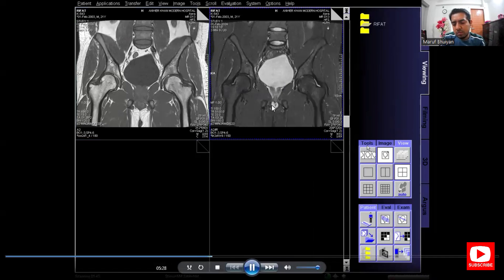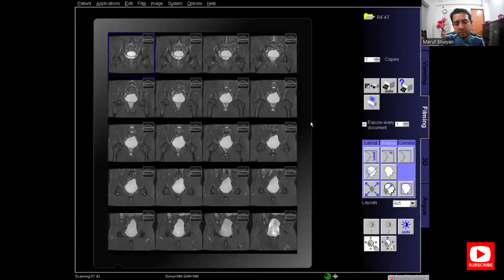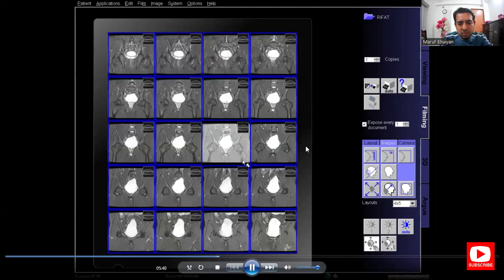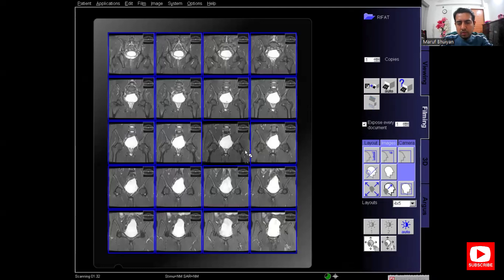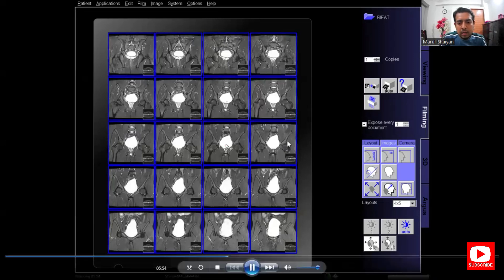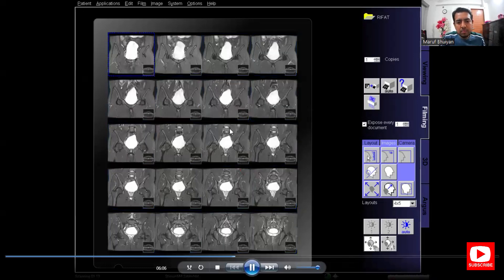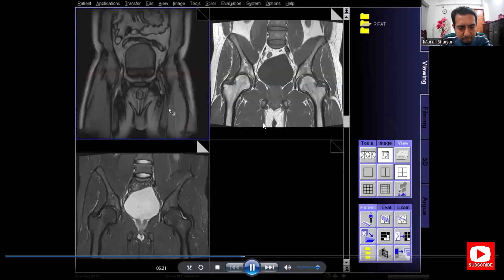On the same process for the PD facet coronal, select the series and send it to the film sheet. The filming layout is 4x5, meaning 20 images per film. Adjust the window and set the reference images at the bottom. The images are in reverse order, so select the series and reverse order to correct them. After proper filming, click the Print button. My first and second coronal films have been printed.